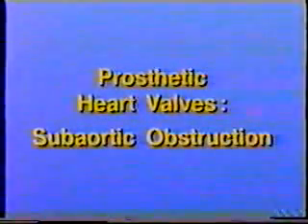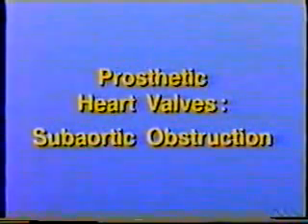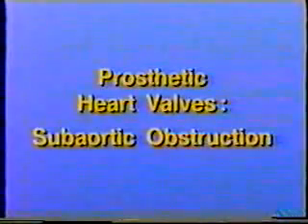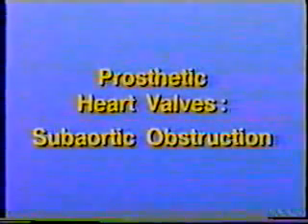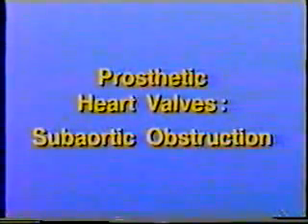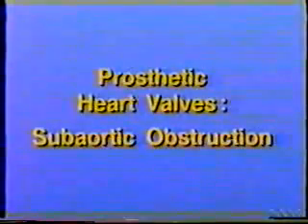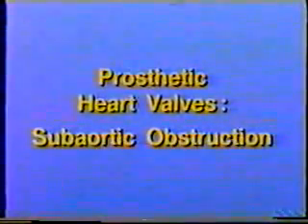Patients with prosthetic valves can manifest subaortic obstruction, which can be diagnosed by echocardiography. For aortic prostheses, the subvalvular stenosis is dynamic due to left ventricular hypertrophy that developed before implantation of the prosthesis. Mitral prostheses can actually cause LVOT obstruction.